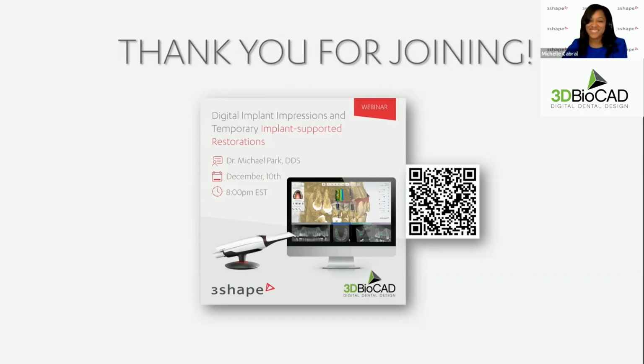I can understand why you want to use a 16 millimeter long drill, because it's in the posterior and there's not enough space. There are a couple of ways to do it. One way is not to do it flapless. Raise a flap, and then you can do the surgery as long as it's not touching the bone. Now, if you absolutely want to do it flapless, one thing is you can move the guide sleeve up, but then you might need to use a 20 millimeter Straumann drill.